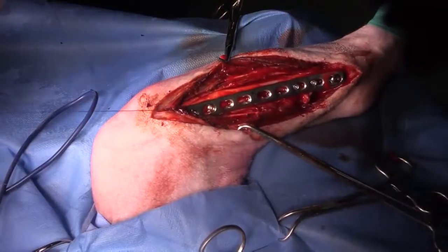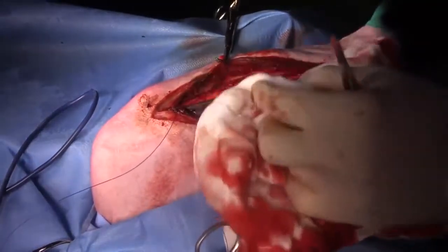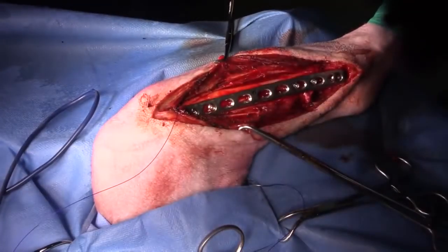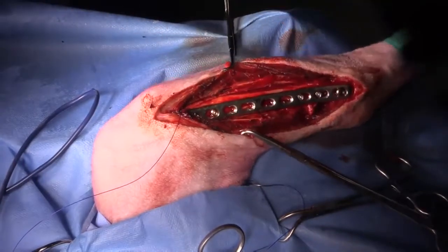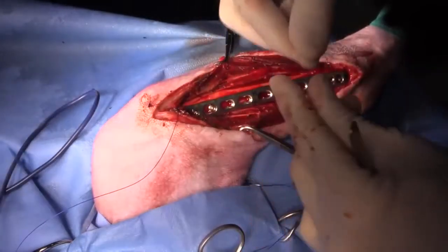Can I get some 3-0 PDS? I'll just tie off these saphenous veins on either side.